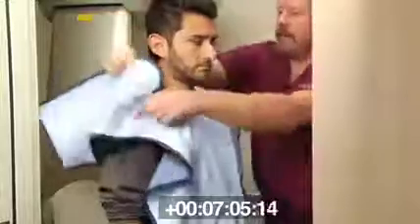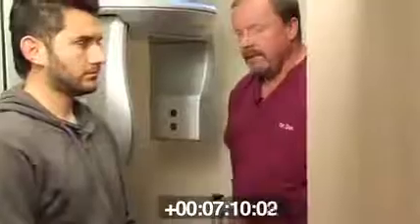And just step out. And that's pretty much it on the scan thing. And now it's about a 35-second wait for the image to process, and we're able to get Vince back to the operatory and begin looking at his images in less than a minute.